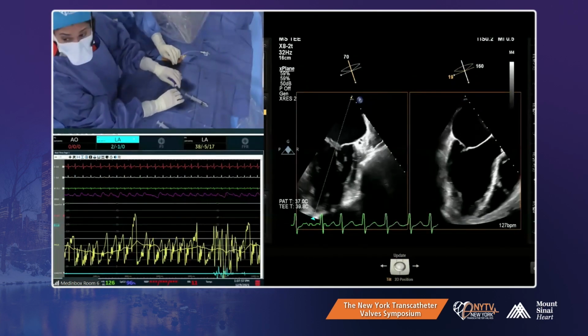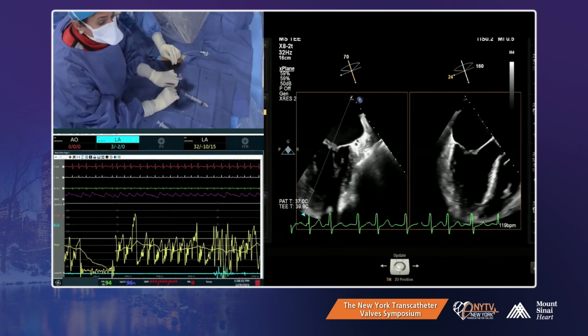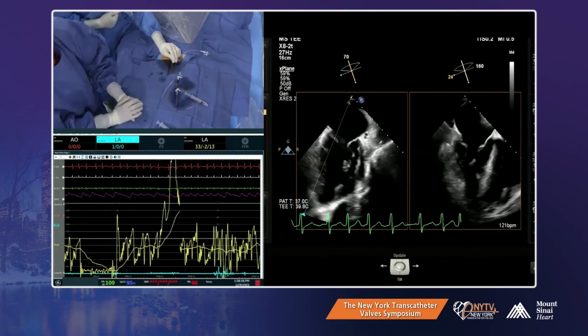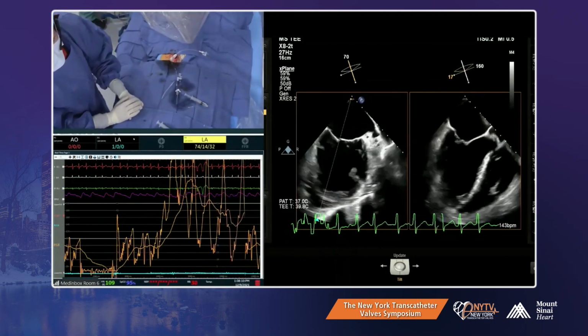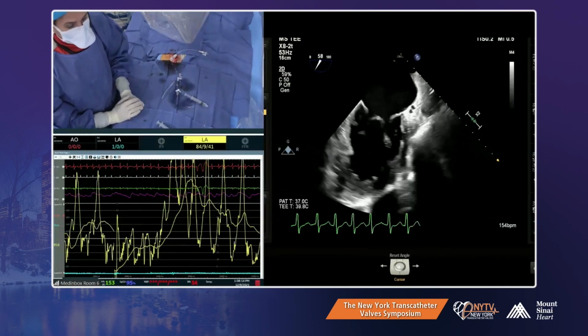Show us the hemodynamics. LA pressure. Yeah, 18. Okay, how is the LA pressure? About 34? Let's see if you can get us a stable waveform. I like to see how big the V wave is too. Can we slow down the heart rate a little bit for us also?